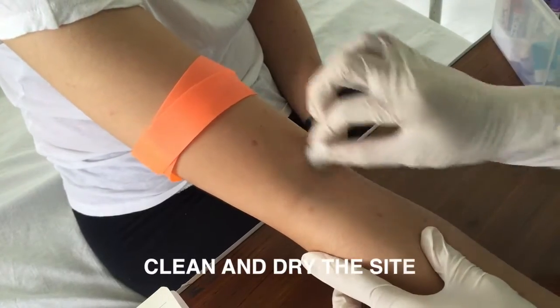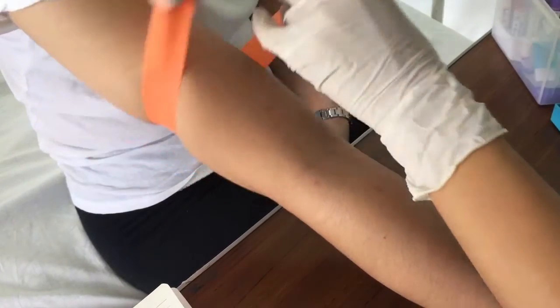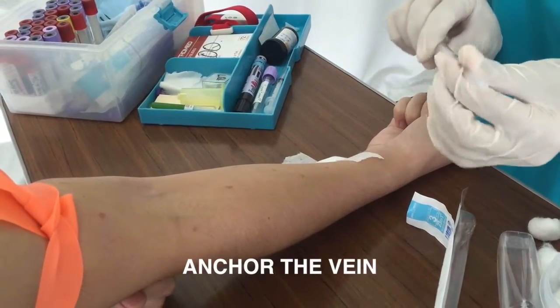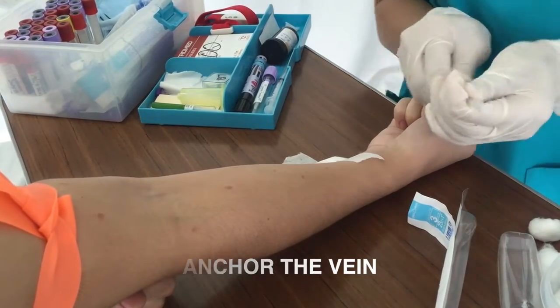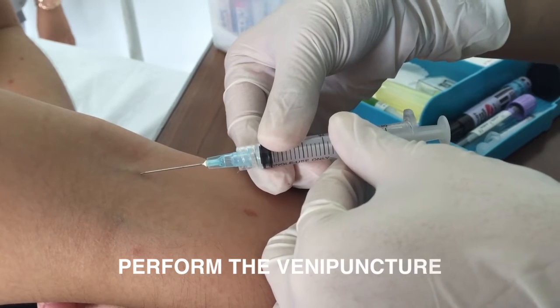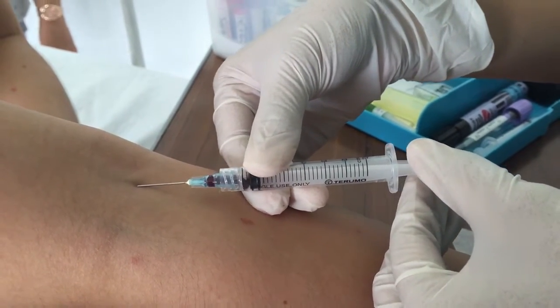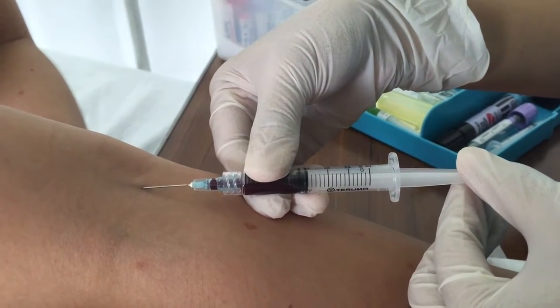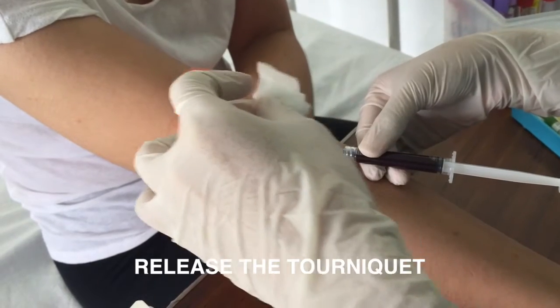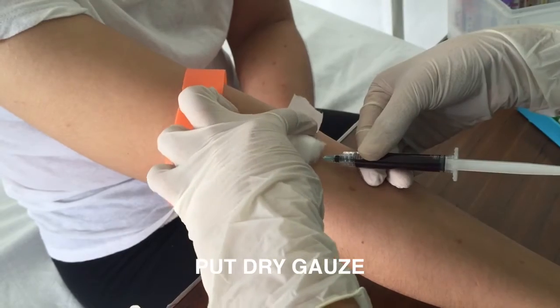Clean and dry the site — clean with an alcohol pad and let it dry for 30 to 60 seconds. Anchor the vein using only the thumb or index finger. Perform the venipuncture by inserting the needle in bevel-up position at 30 degrees or less. Release the tourniquet — never leave it on for more than 1 minute. Put dry gauze over the site.